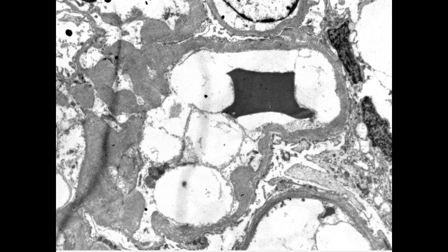Of course, we have some artifacts which are linked to the reprocessing from paraffin. This is a low power of a glomerulus, and it showed this material here, which is mainly in the mesangial area, and there is also some of this material here in the subendothelial space.